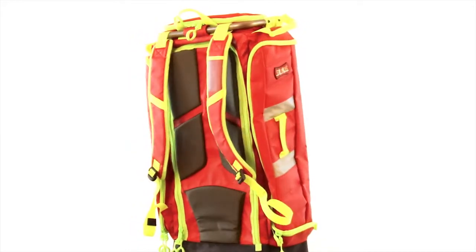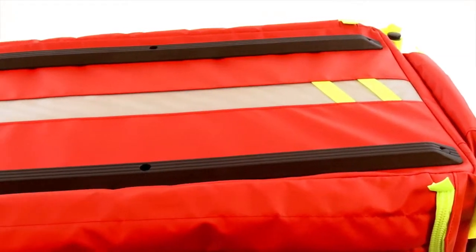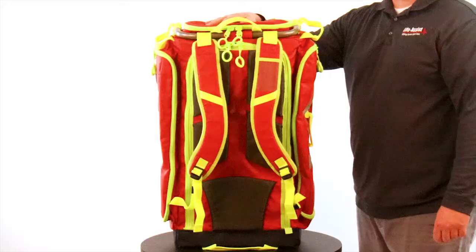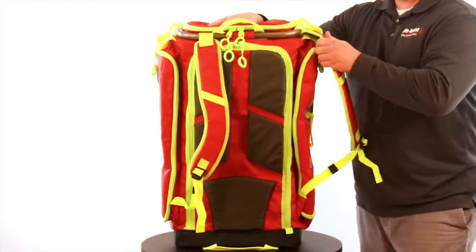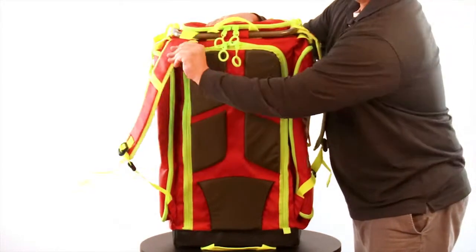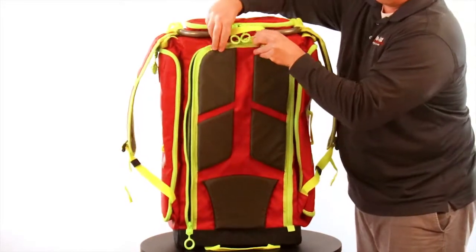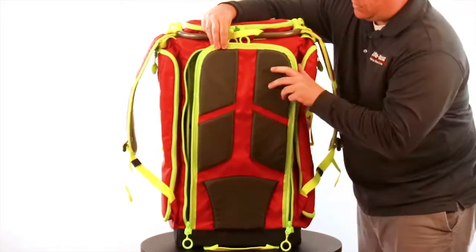Skids, located on the front of the pack, protect it from daily wear and tear, lengthening its lifetime. A unique shoulder strap design with a lightweight aluminum slide track not only keeps them from getting dirty, but also keeps them out of the way when accessing the main compartment.